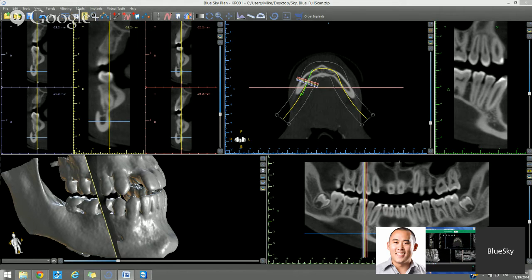We also have a help file that has a lot of information built into it that's accessible via the software at Help, Show Help. In addition, we have short feature-focused videos on our website that could be accessed. And of course, with any questions or to set up a personal training session, we could be contacted directly.